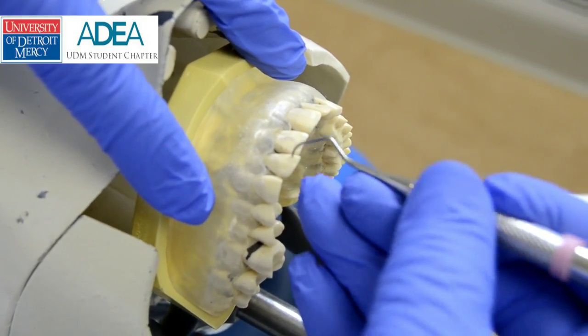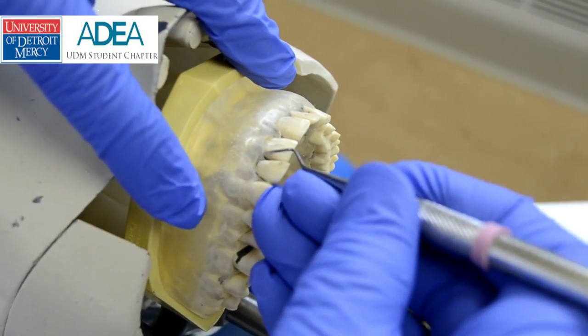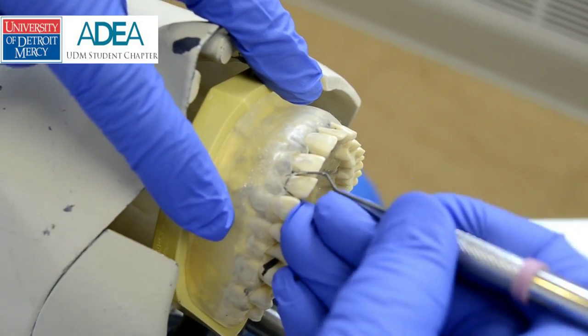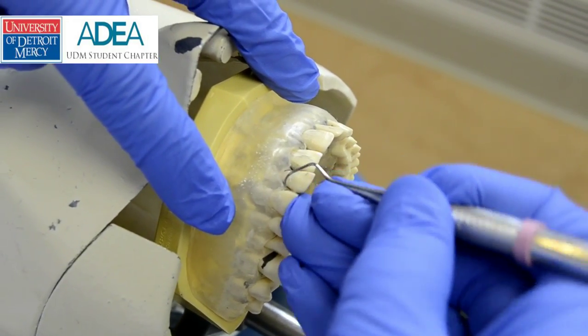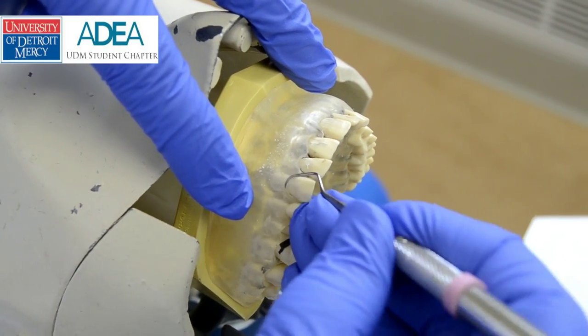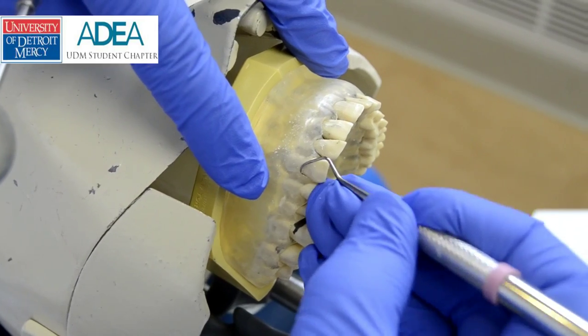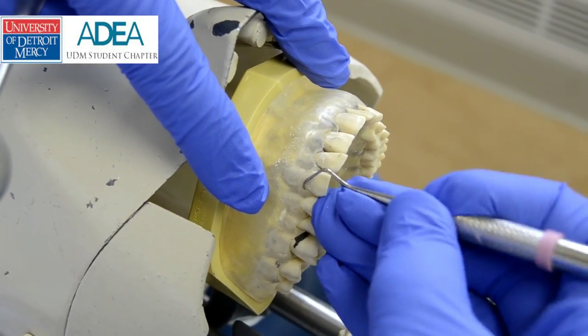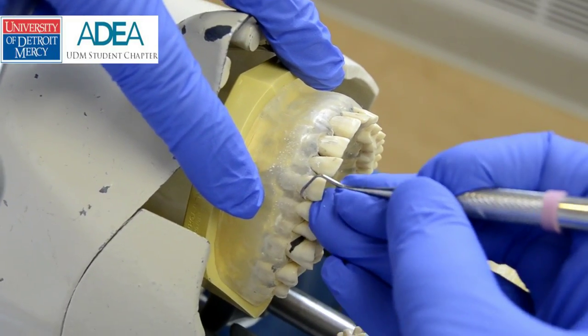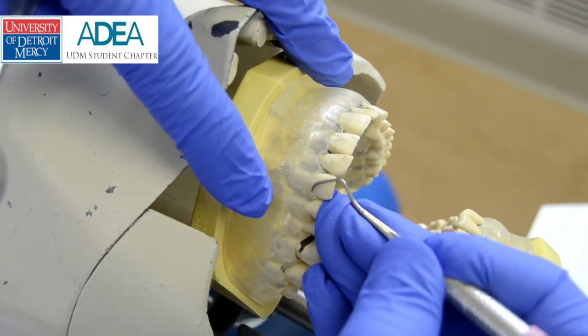I flip the instrument, start at the midline again, firm fulcrum, one tooth away from where I'm instrumenting. Short, controlled strokes with vertical strokes to remove the calculus. I can pivot — notice what I did — I can pivot on my fulcrum to adjust the angle of my blade.